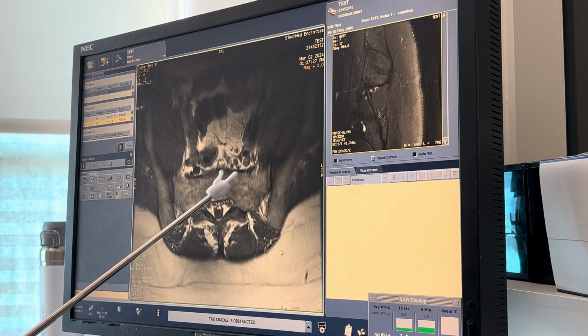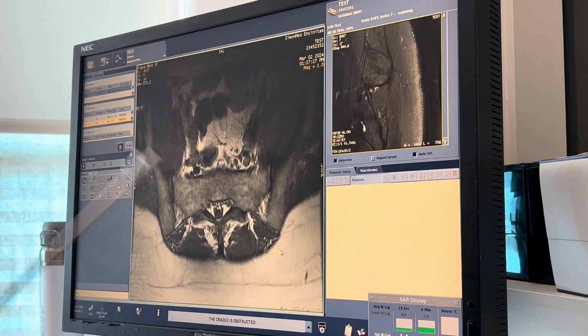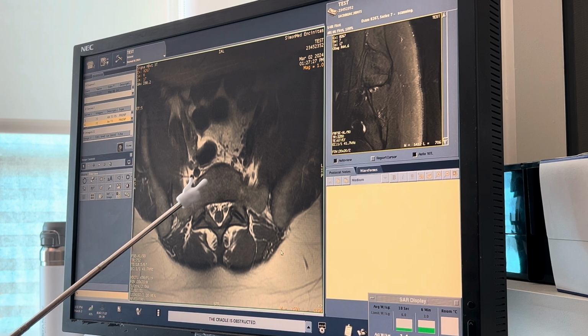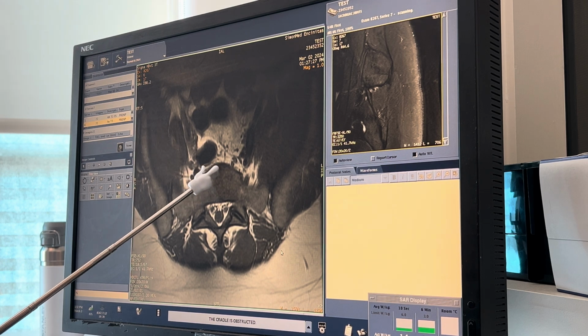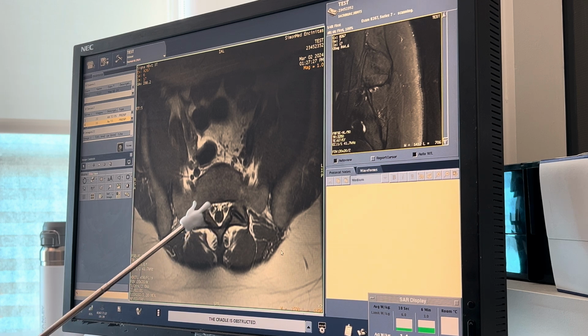Keep going. Anterior concave, and it looks like we're about to hit the anterior sacral promontory right here. Let's go up one more. Keep going. Maybe not. No, other way. Keep going. Yeah. There you go. Sacral promontory. That prominent ridge anteriorly separates the abdominal cavity from the pelvic cavity. It also serves as the landmark, forming the promontory angle with L5. Okay, you can clearly see the sacral canal right here, spinous process and whatnot.